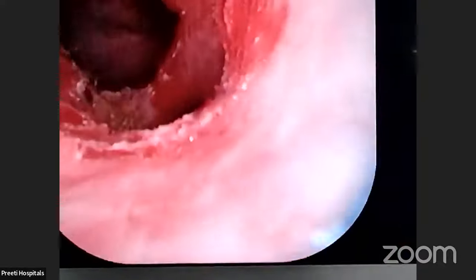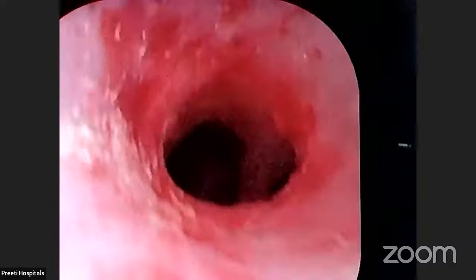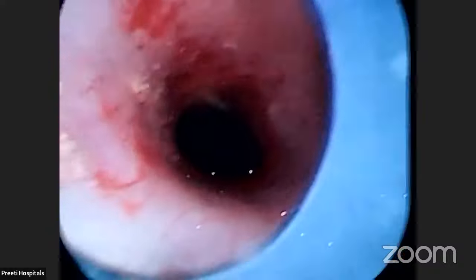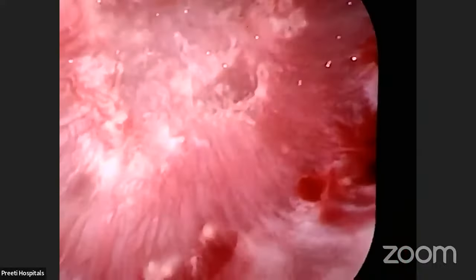Yeah, this is cleaned. Now this is the left side kidney. See, no powder at all. So long infundibulum. Now I will come to the middle calyx. Middle calyx, see, suck. Now whether my sheath will reach this or not, if it draws, see, it will push. Push a little bit. That is the dangerous thing.